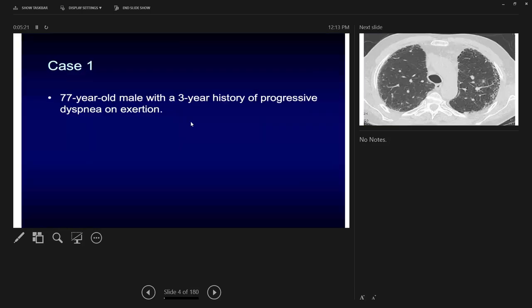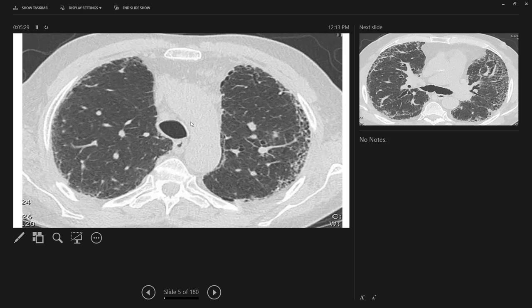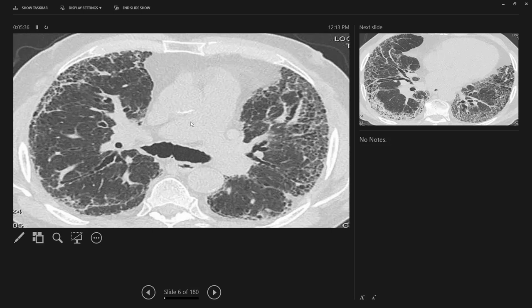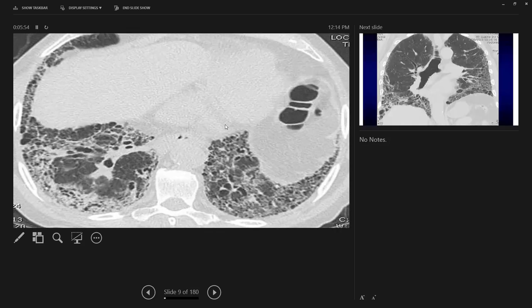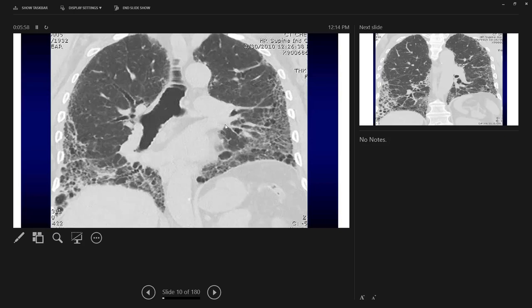For example, this case: 77-year-old male with a three-year history of progressive dyspnea on exertion. The CT scan is predominantly reticulations. The coronal section gives you a quick overview of both lungs so you can immediately narrow down what you are dealing with. Here you can tell you are dealing not with nodularity but mainly with reticulations.